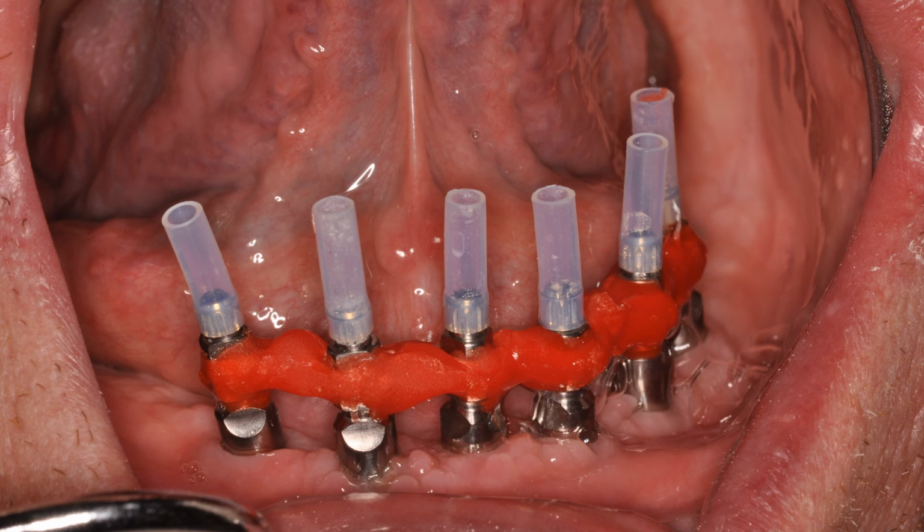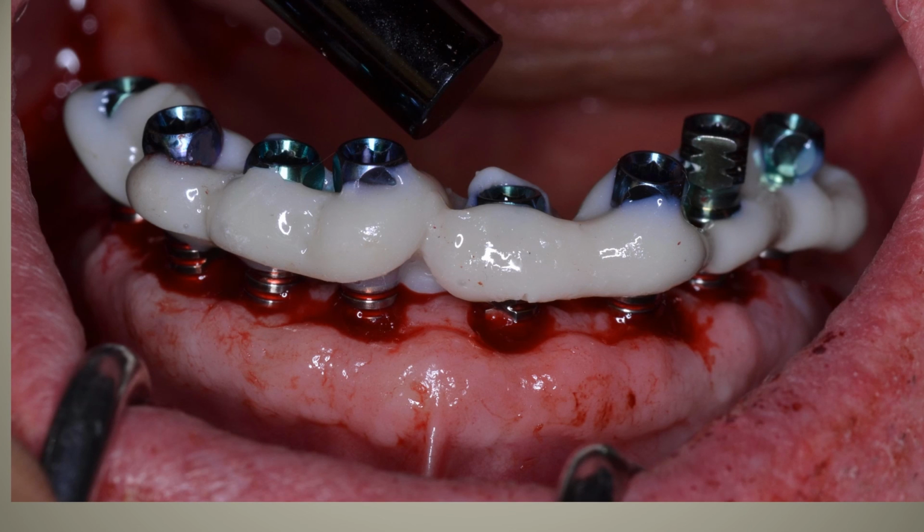In the next picture, this is a picture of a patient of mine. You see 8 impression copings placed in the patient, and these are locked together with composite resin. And I don't have a photograph using Triad just because it doesn't work very well. It's too much shrinkage, and you're going to end up getting not a very accurate impression for your patient.